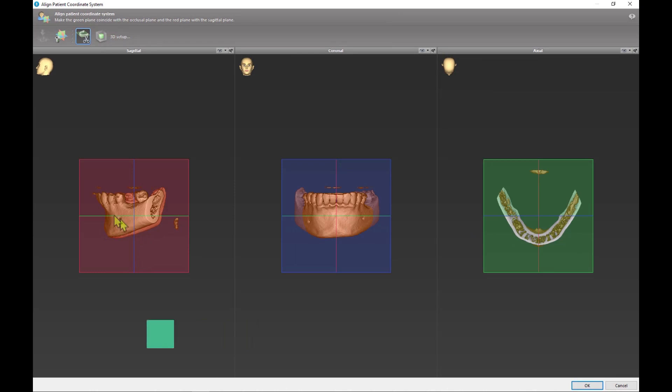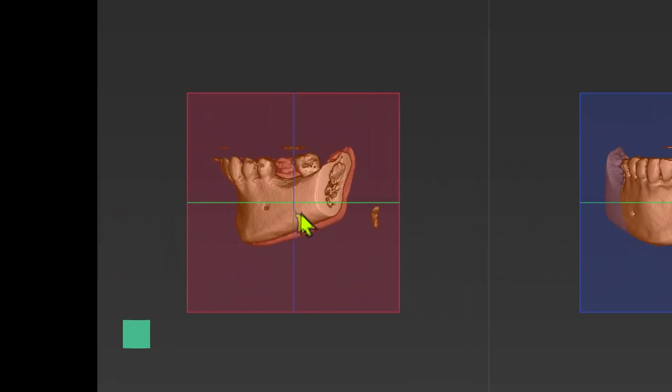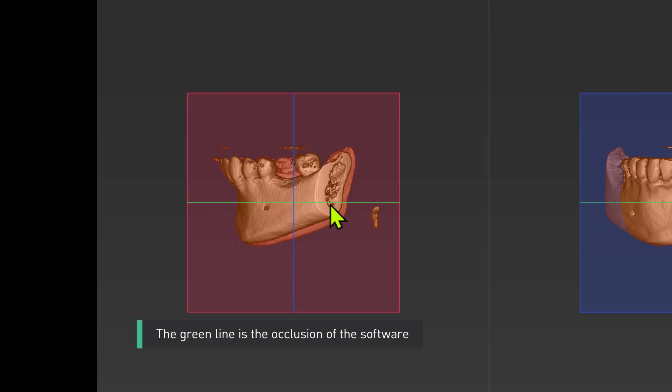And the blue, green and red lines and planes. The green line is the occlusion of the software.